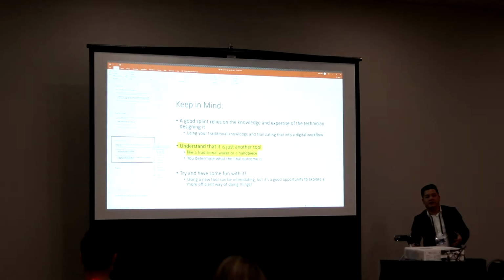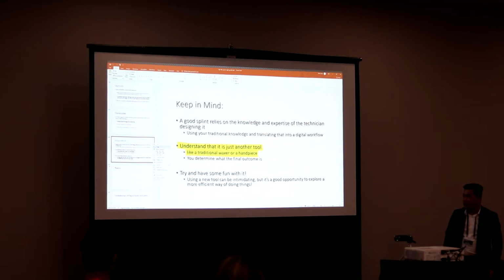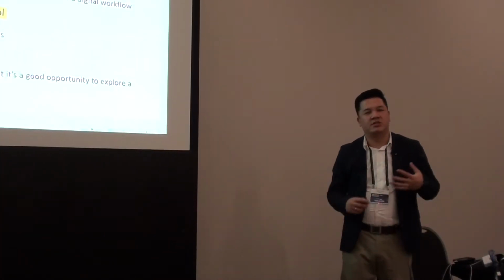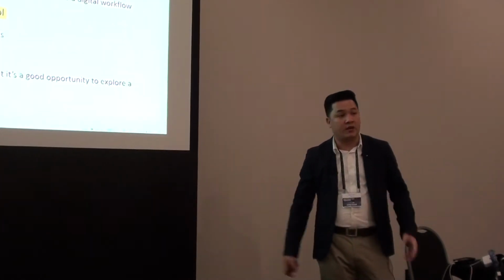So usually when I teach any type of course, or a lot of the time in recent years where we've moved a lot of it online, I end up copying and pasting this slide here onto a lot of my presentations, and I kind of focus on this part right here. And 3shape, a wax knife, a hand piece, pretty much everything that you use is just a tool to help us to really facilitate our work and in order to produce the products that we need to produce.